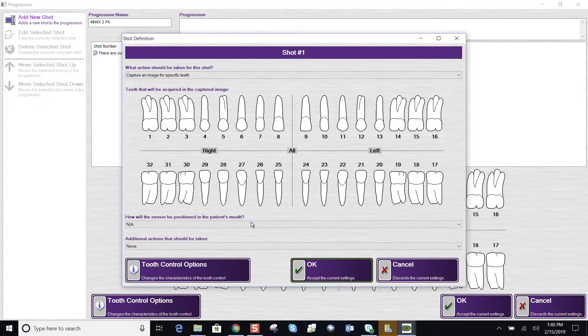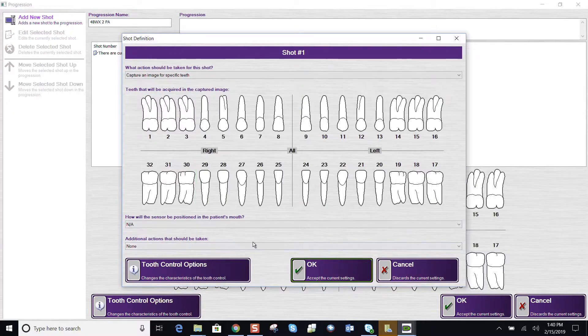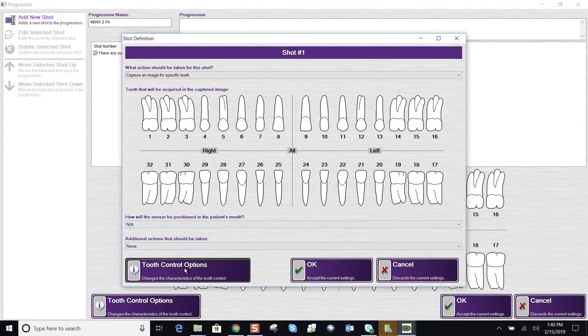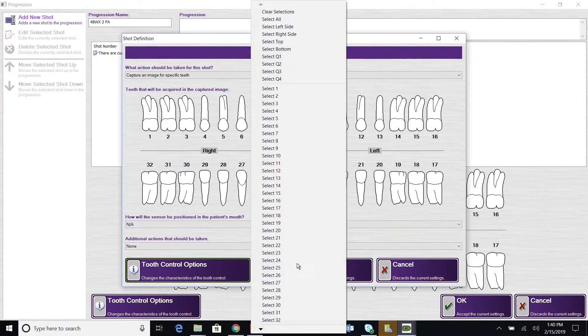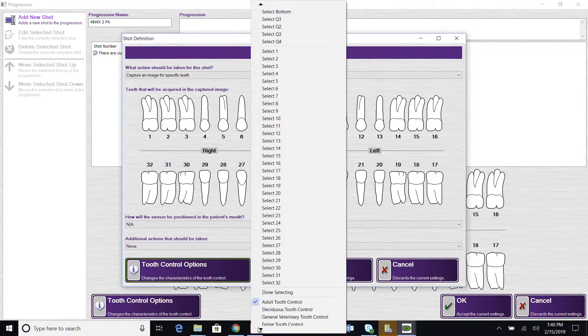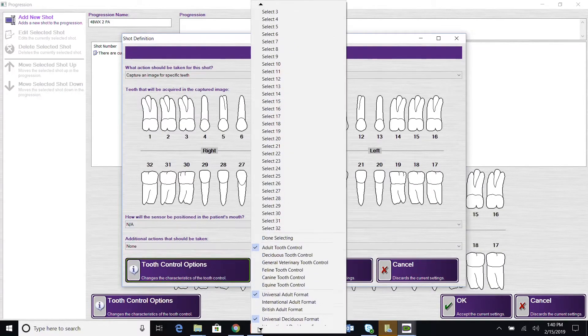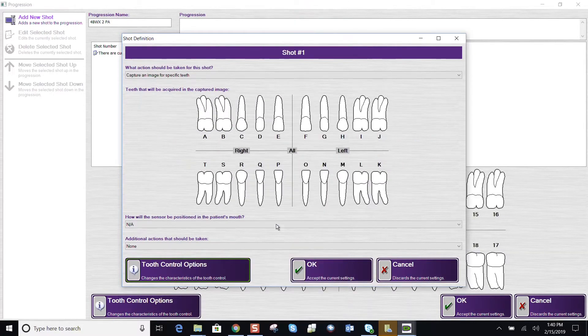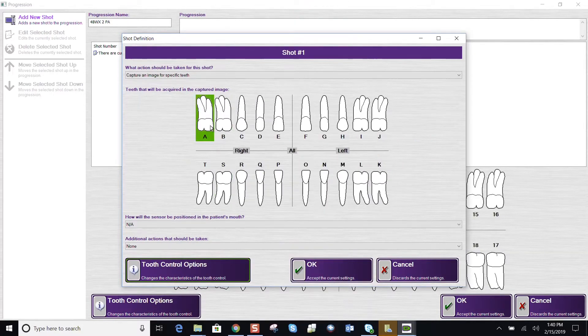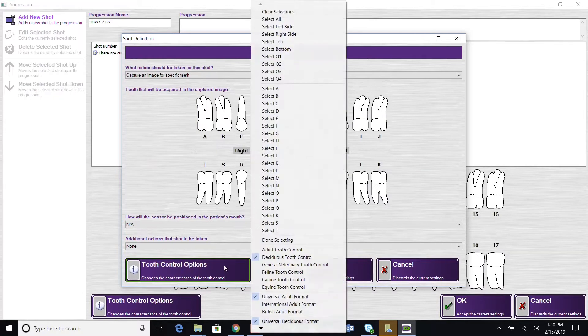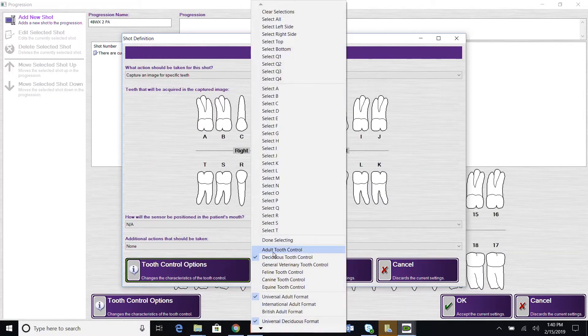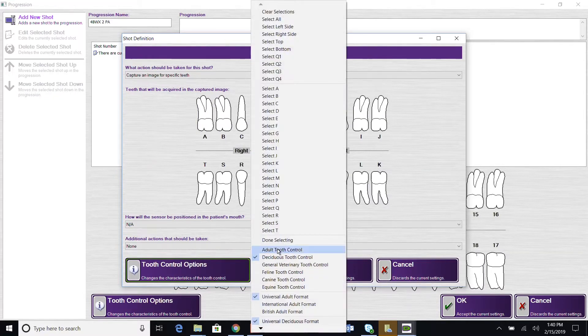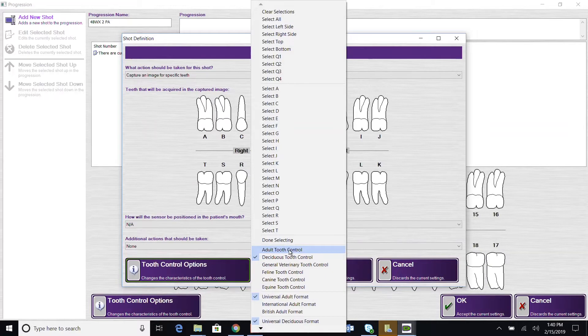If we needed to create a chart layout for deciduous teeth, come to tooth control and find the arrow down and you would select deciduous tooth charting. And now we have our A to T. I'm going to create for adult bite wings. So I'm going to go into tooth control and go back into the adult tooth control.